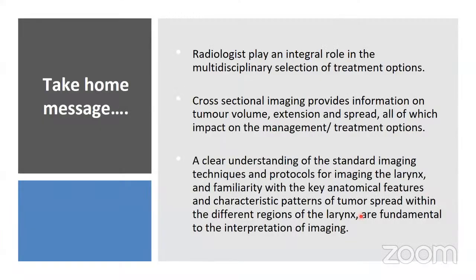So with that, these are my final slides: the radiologist definitely plays an important role in multidisciplinary selection of the treatment options. It's very important that you select your cross-sectional imaging appropriately and supplement with MR if needed, which gives you the tumor volume, the extension, and the spread, which does make an impact on the management and treatment options. It's also very important that the reporting radiologist should be aware of the standardized protocols, the familiarity with the key anatomical structures, and also the patterns of spread, which is fundamental for interpretation.